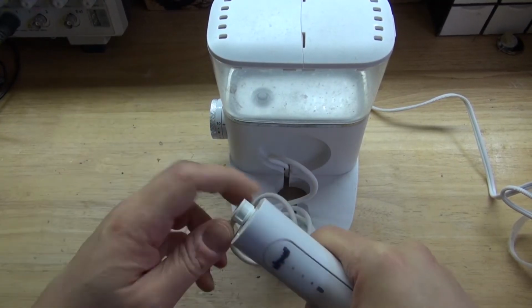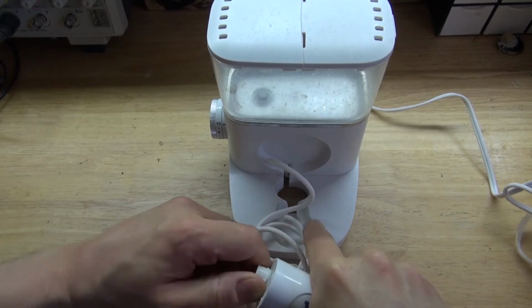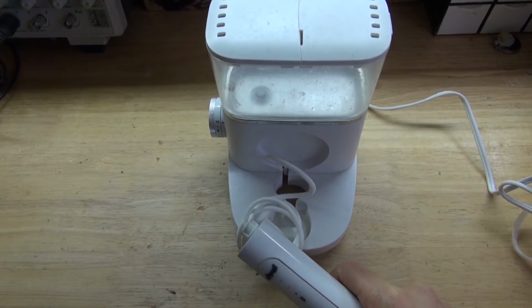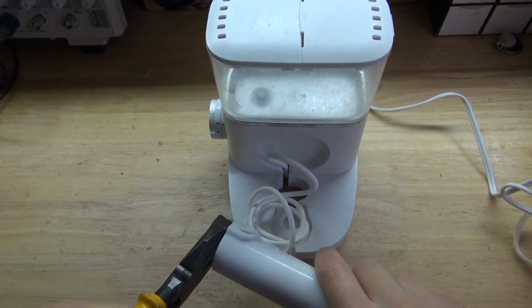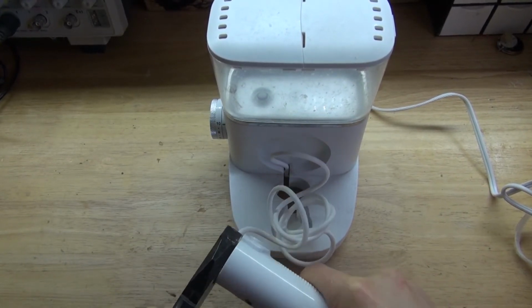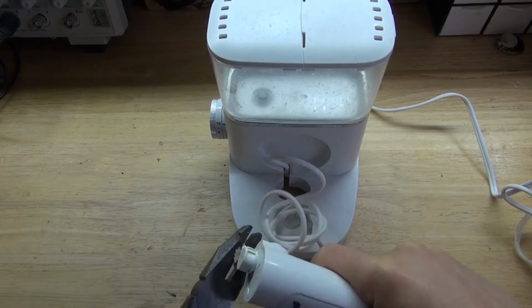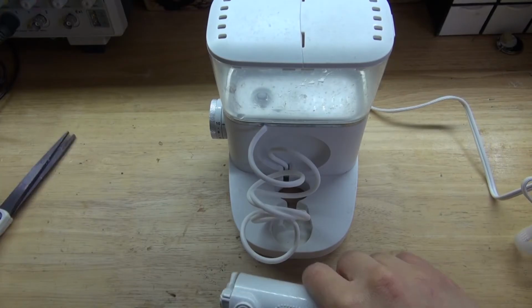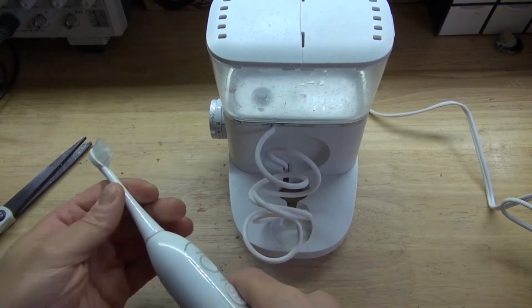It looks to me like right here just simply unplugs. So just simply pull it, but it doesn't come out that easily, so what I need to do is take a tool and pull it out. Having difficulty pulling it out, and it's not quite coming out, so what I'll just do is cut it. And this part here removes easily.